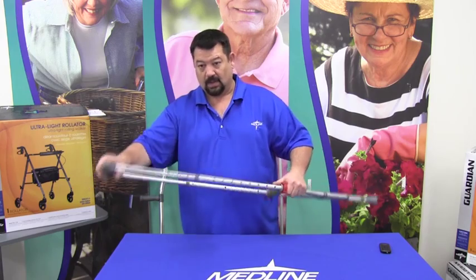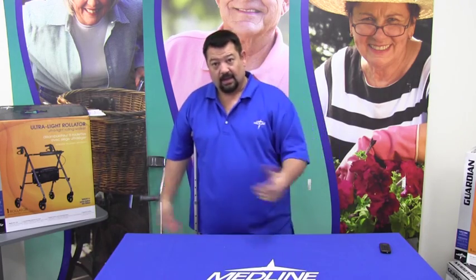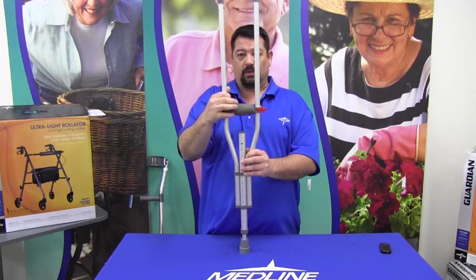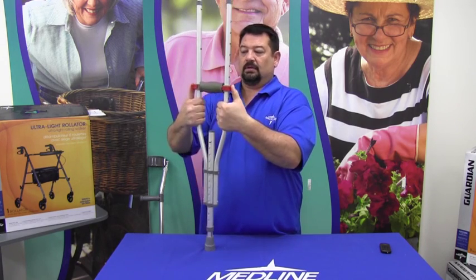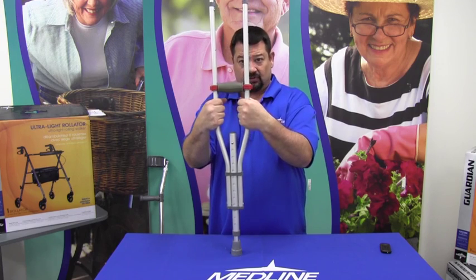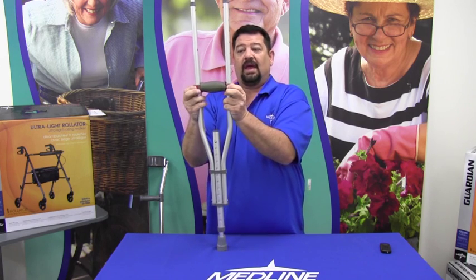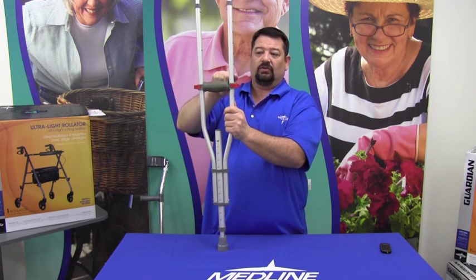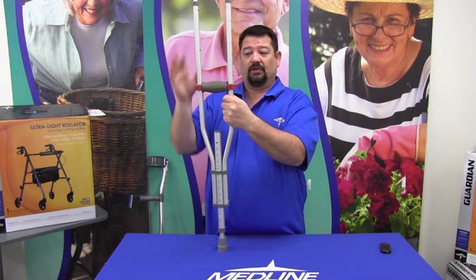So now we have a crutch that started out at 3 feet long, and now we have a crutch that is actually, I'm 5'8", and is designed to go even higher. Again, this push button is how you adjust it. Here's a little catch. These hand grips have these little red clips on the outside edge. Once everything is sized and connected, it has to be a secure, solid fit, so these red clips do double duty. They don't just lock the hand grip in place, they actually lock the whole structure into place. This tube fits down into here, and these holes correspond to holes inside the inner tube, and when you connect them all, it locks them all into place so nothing else can be adjusted.